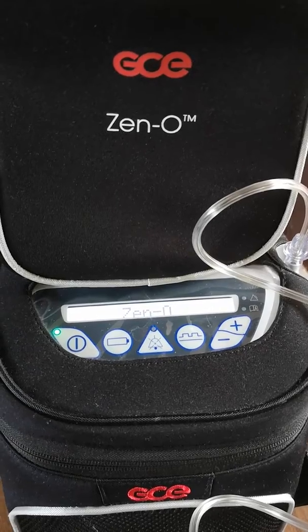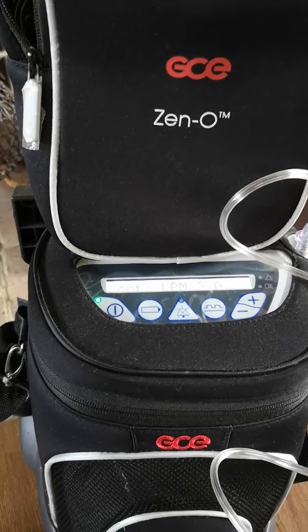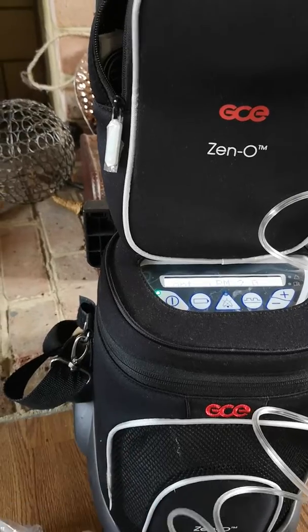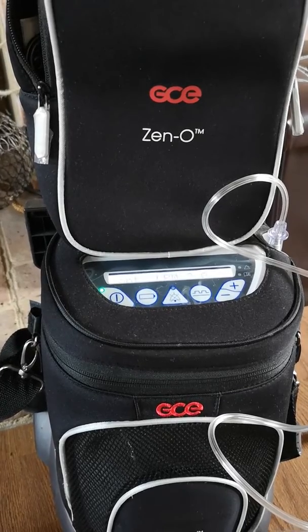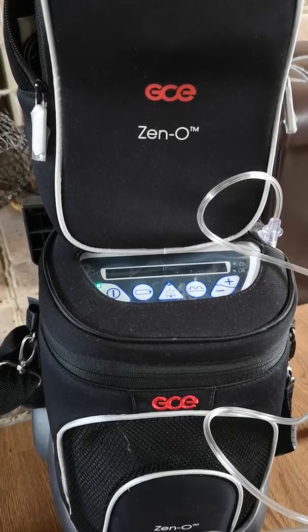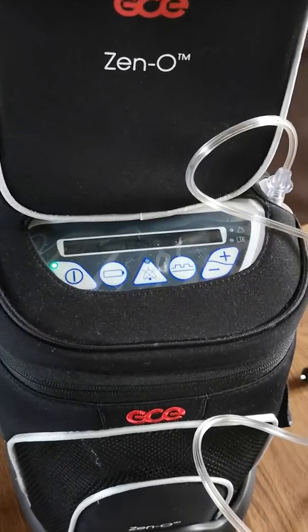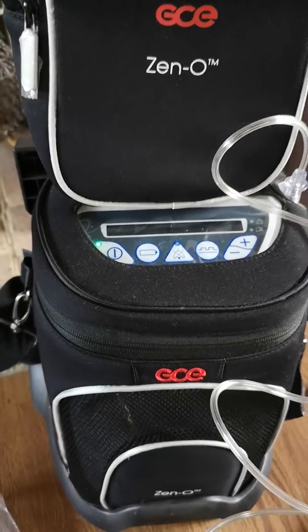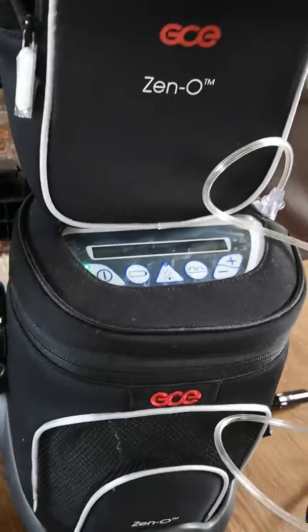Now I've set this to two litres continuously — there you go, that's how loud it is. We need it continuously because Alfie has cerebral palsy and he can't control his breath. You can have it higher at three, and I think this one goes up to five, but don't quote me on that. I only needed it to go up to two continuously, and that's how loud it is.